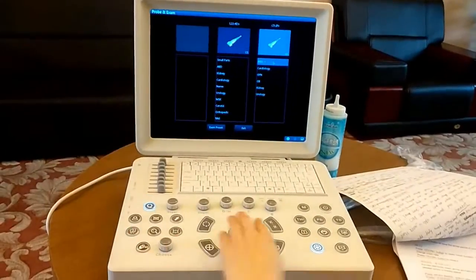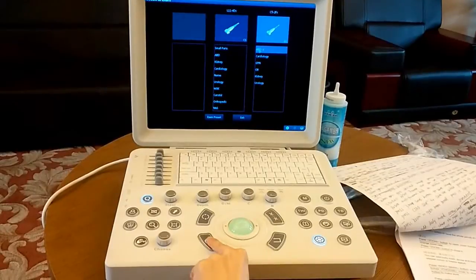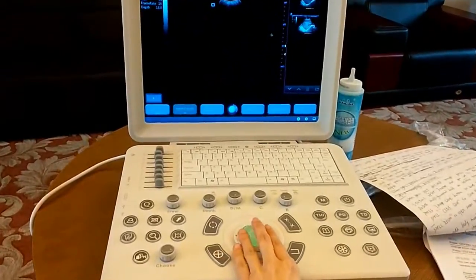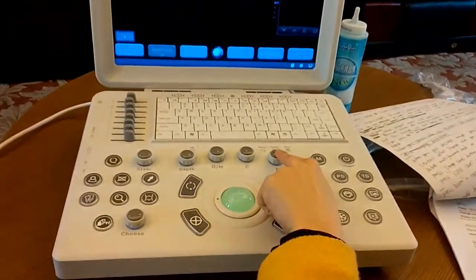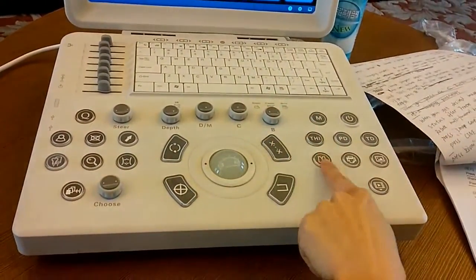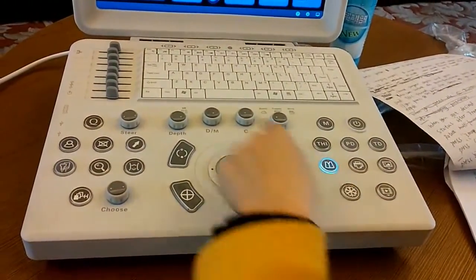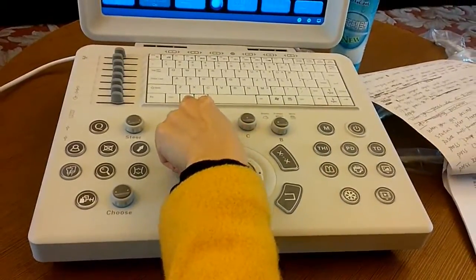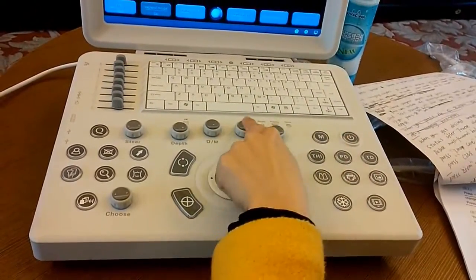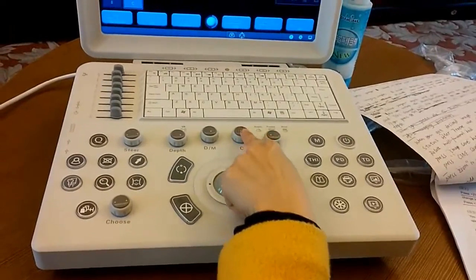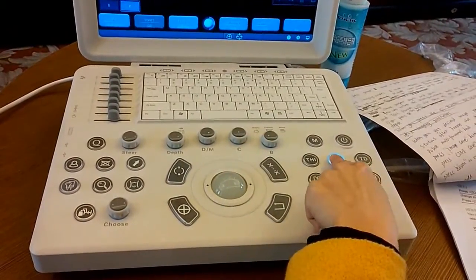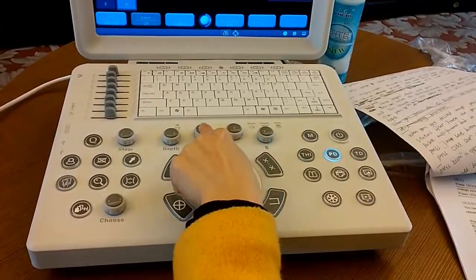Press the probe button, choose a probe and application, and click it. About imaging modes: B mode is the default. There is also 2B mode, 4B mode, M mode, C mode for color, PD button for power Doppler mode, and D mode for PW mode.